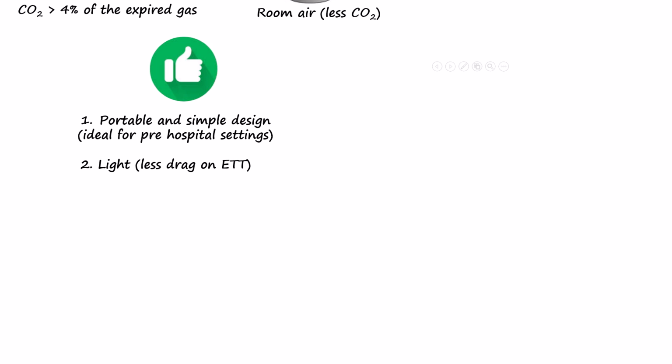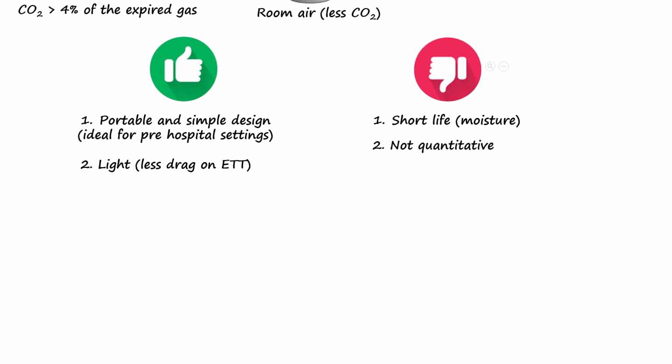Despite their benefits, colorimetric devices also have notable limitations. They are intended only for short-term use, typically less than 30 minutes. Moisture from exhaled gas can cause them to become saturated, rendering them non-functional. Importantly, these devices do not provide a quantitative measurement of carbon dioxide.